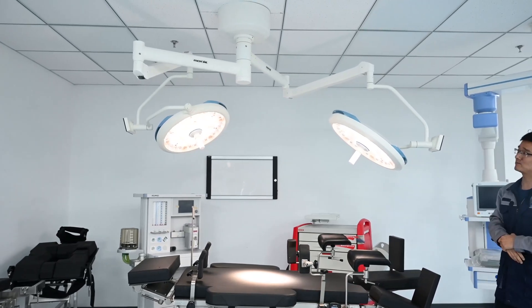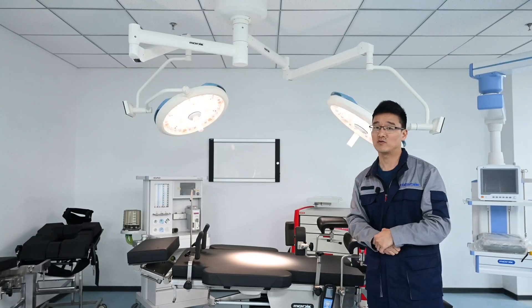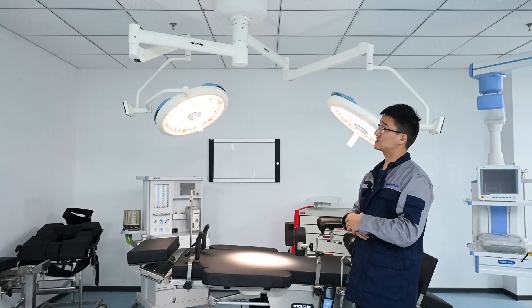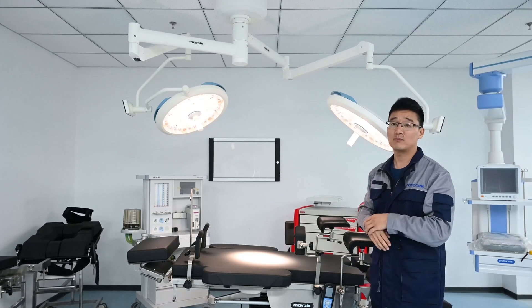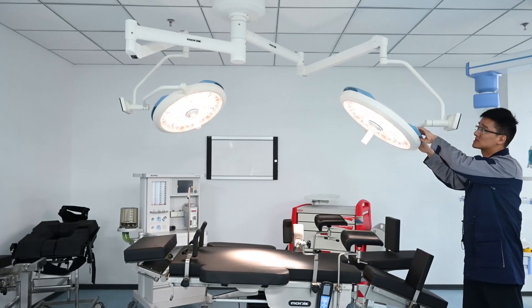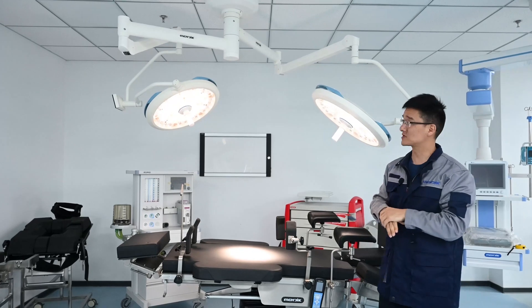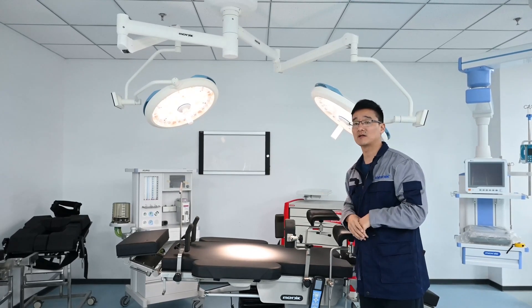The third part is the lamp itself. Mechanically, a good surgical lamp must have proper installation and a good quality, stable spring arm. Now for the next step we will introduce the lamp itself regarding the light parameters.